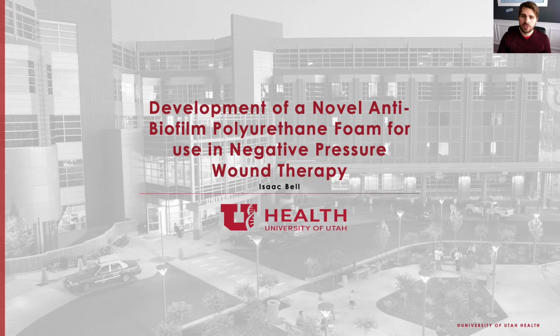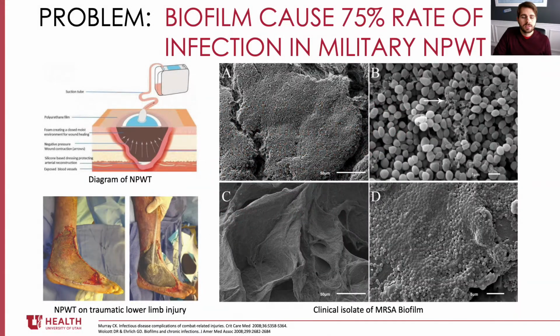I'm going to draw your attention to the specific key takeaways from each of the slides. The problem and background is that biofilm causes a 75% rate of infection in military negative pressure wound therapy. To understand this, I want to share with you what negative pressure wound therapy is.